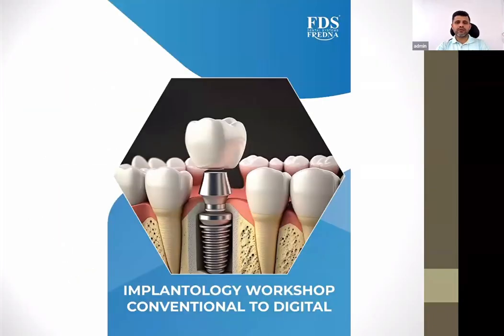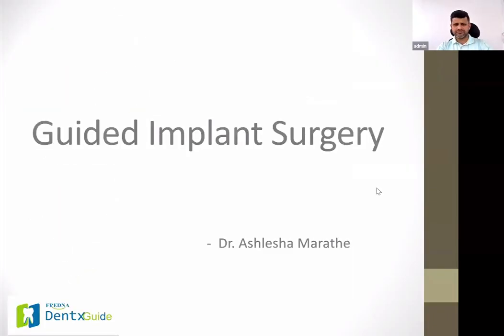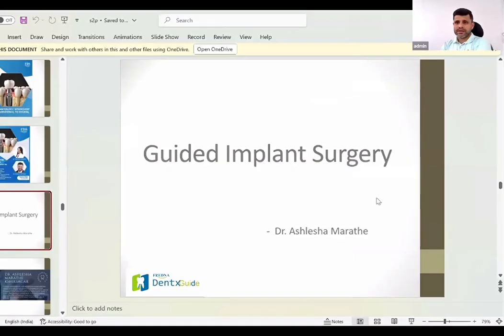So this is about the CBCT. Any doubts, any questions you want to ask me related to CBCT? We can discuss now.